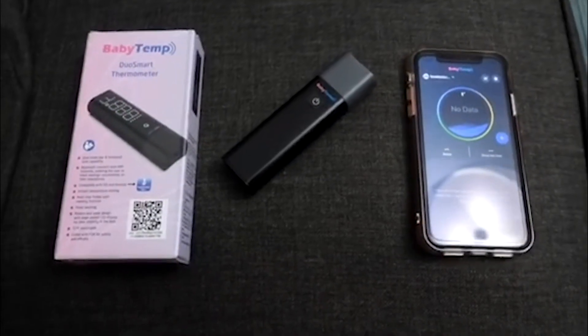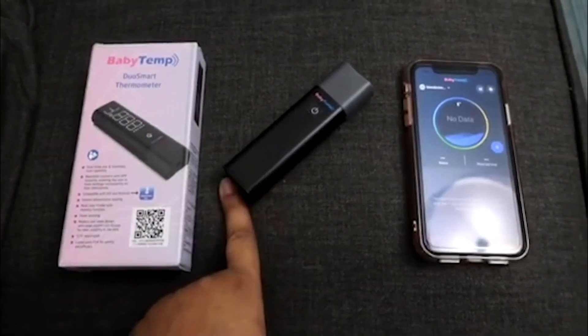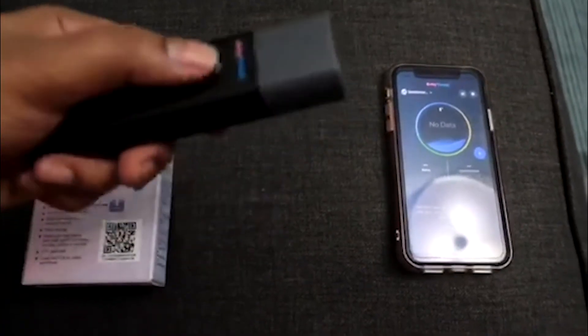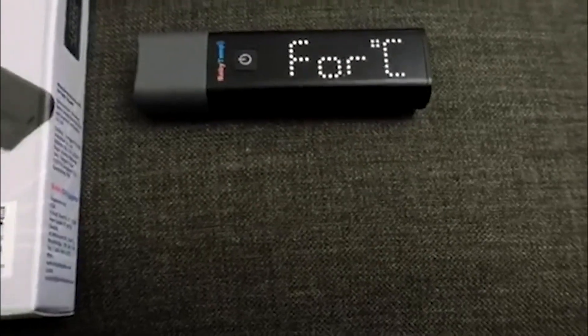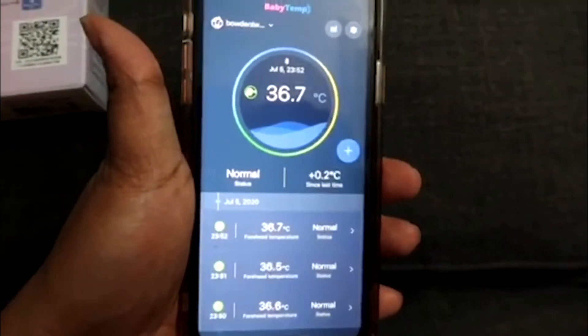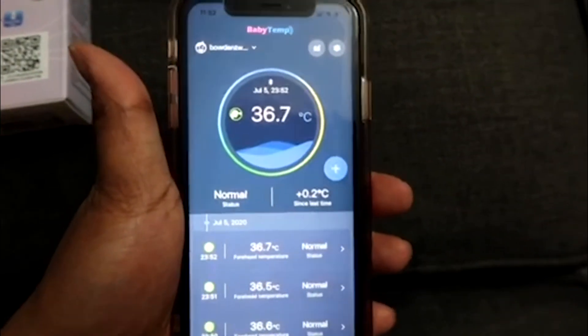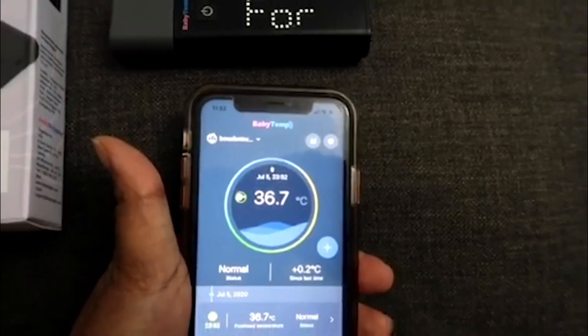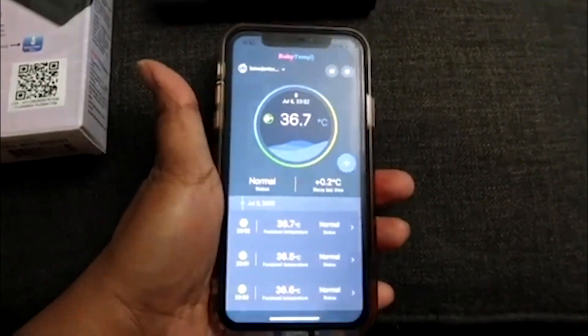You're able to store and share your temperature data using the Android iOS app. So whenever we take a temperature reading using the thermometer, Bluetooth automatically reads that temperature reading and logs it and saves it, which is super easy, super fast. All I did was place the phone next to the thermometer and it automatically got the reading.